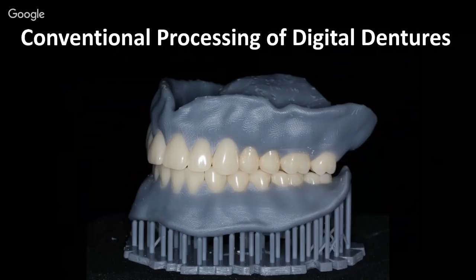Once you are clear of that, I would take the teeth out. I would now cut in some retention. So I have a little high-speed handpiece in my lab, and I will just put on a big carbide surgical length burr, and I'll punch several little holes to create some mechanical retention on the underside of the tooth. Or I can even hollow out the tooth a bit, put in undercut areas. Again, the idea just being to mechanically retain the tooth.